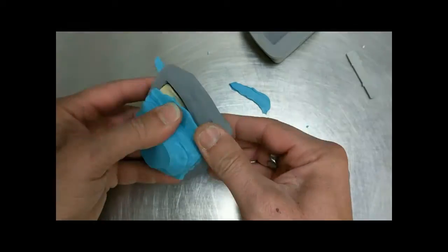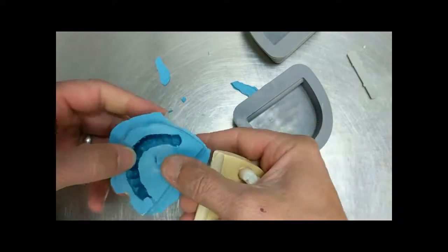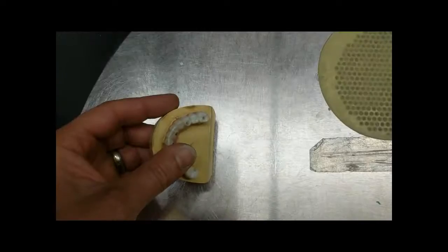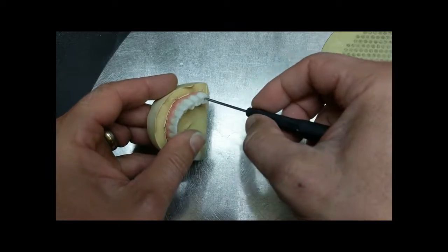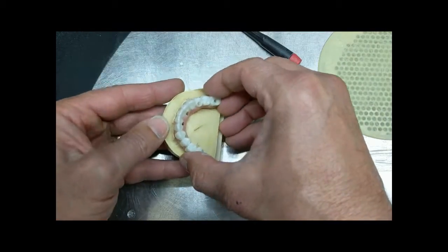At this point, inspect the inside of the flask for any voids. If there are any large visible voids, please repeat the flasking part with the blue putty. Then unscrew all the screws from the prosthetic, remove the prosthetic from the stone. It should separate pretty easily.